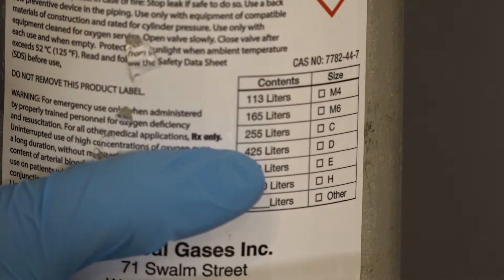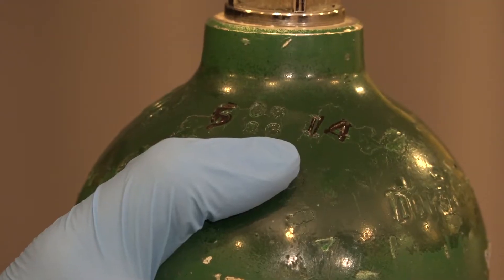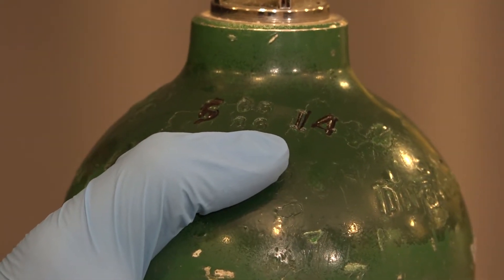We're also going to identify on the label the text 'RX only,' indicating that it's a prescription. And we're also going to check the hydrostatic test date on the tank.